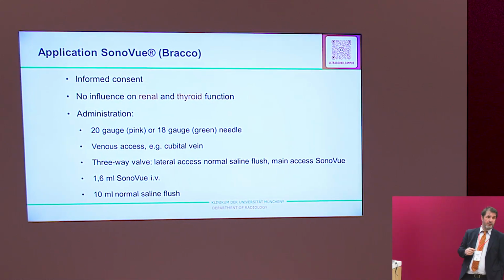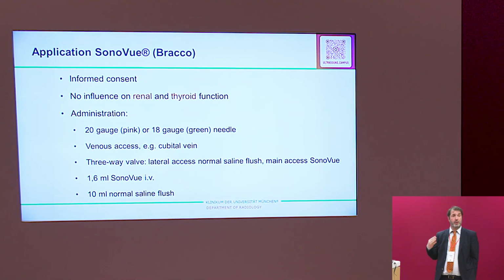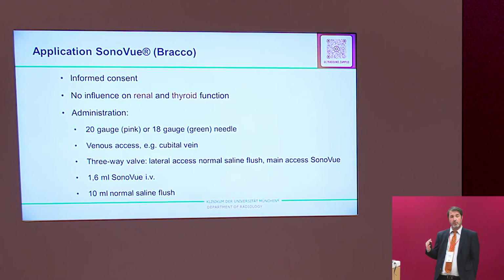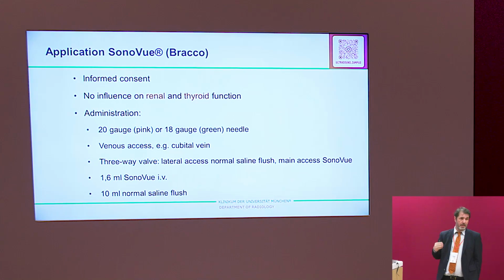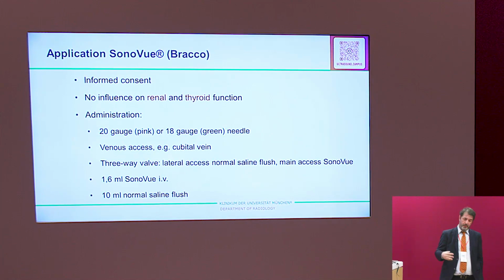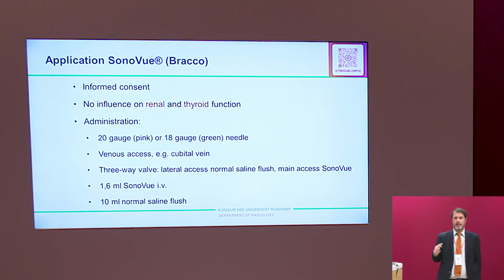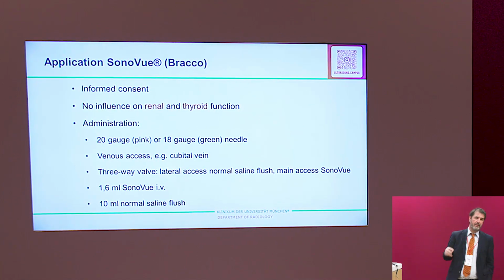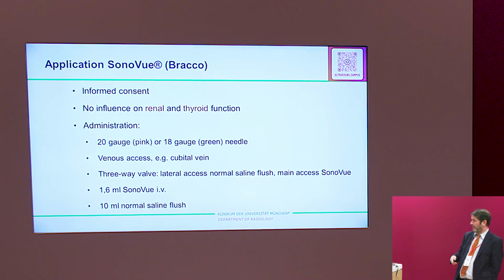All patients have to give an informed consent, so they should agree that you're allowed to inject. Good news is these contrast agents have no influence on kidney or thyroid function. So you can just go straight ahead and inject it if they agree. And the risk of having some side effects is only 1 in 10,000 cases, very, very low.